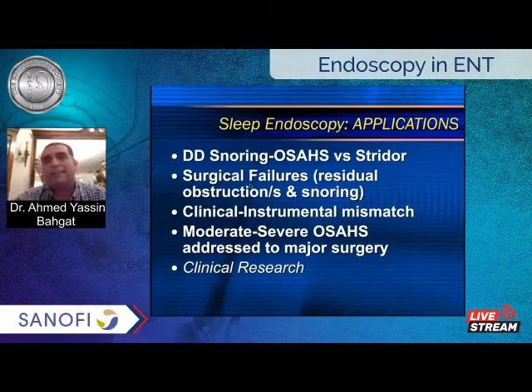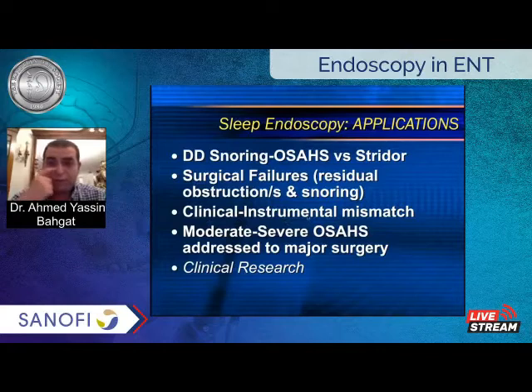If the patient already had UPPP, septoplasty, nasal surgery, tongue surgery, and is still complaining, the patient is usually afraid to have another surgery and more pain without a solid diagnosis. Look for a mismatch between the clinical and instrumental diagnosis. Instrumental means the polysomnography. If the patient is complaining of severe sleep apnea and loud snoring, but the sleep study comes back as mild sleep apnea, you have to judge which is true, and vice versa.